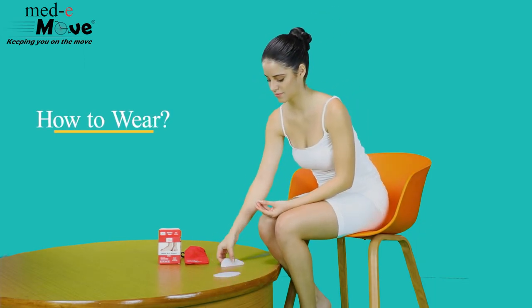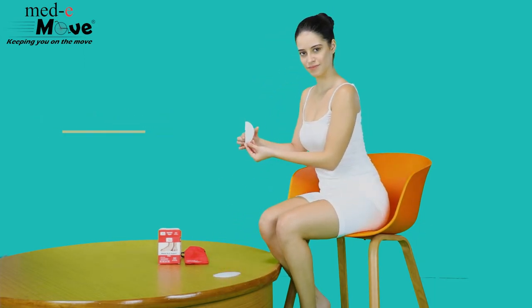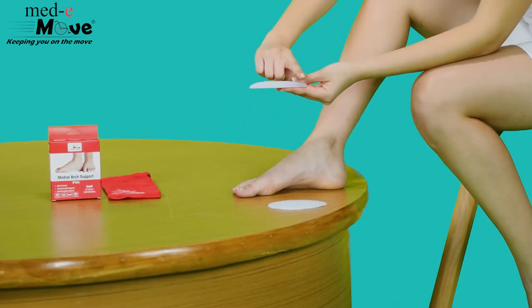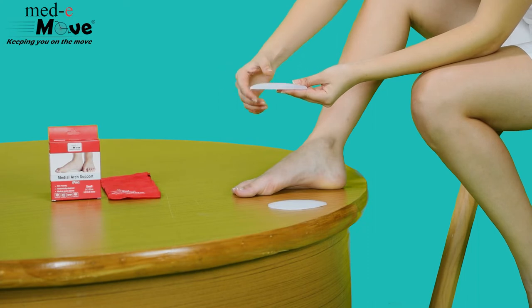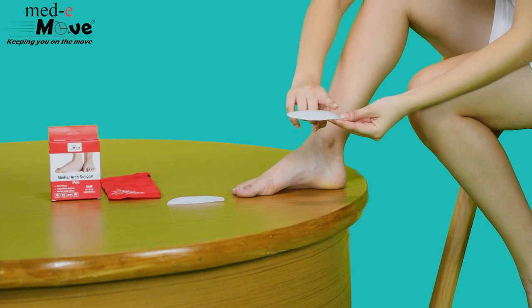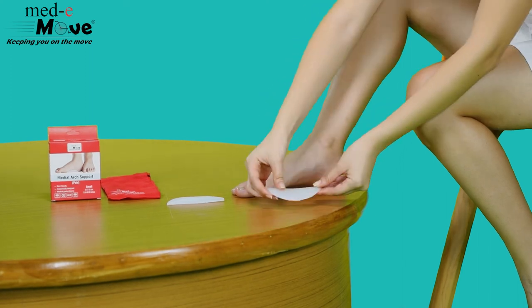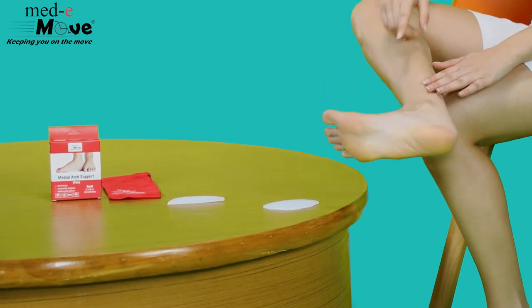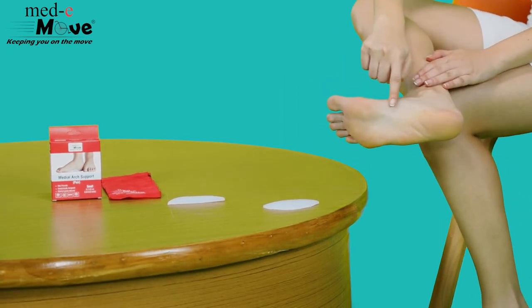Now let us see how to wear the Medimove medial arch support. Ensure that the medial arch is placed in your footwear in such a way that the curve of your feet is placed exactly on top of it. The medial arch needs to be placed at the curvature of the feet.